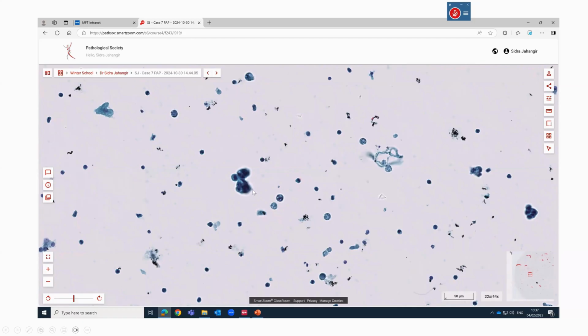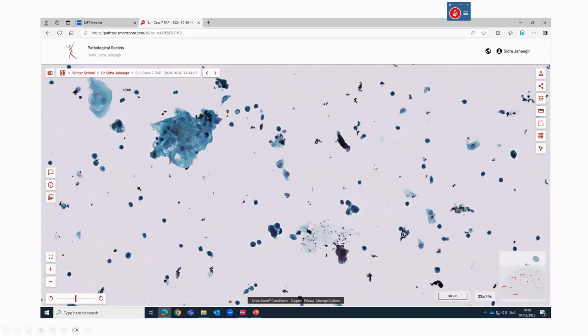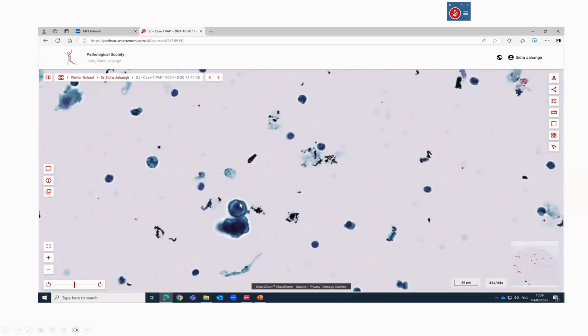So we have small groups with dense chromatin changes. Again, these pleomorphic cells, you can appreciate mucin in the cytoplasm, some signet-type arrangement, bizarre cells. So yeah, this one also has very dirty chromatin, or maybe some mitosis there, and a very bizarre looking cell here.